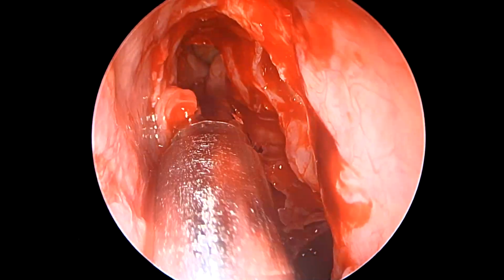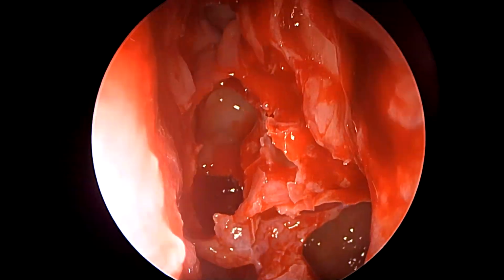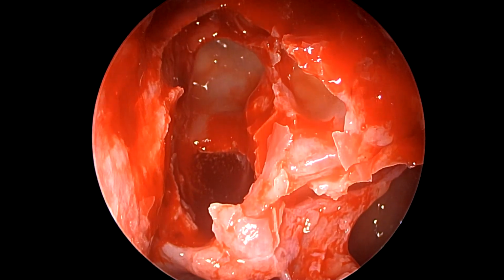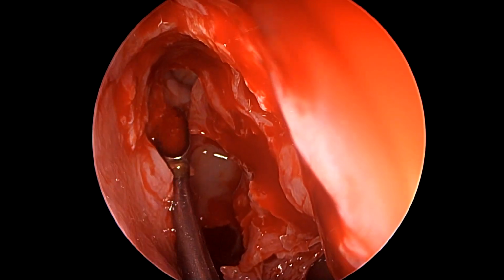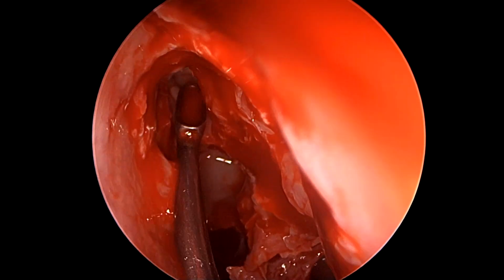So as we see here, once a basic opening has been done, we take our microdebrider blade to remove the septation in the ethmoidectomy cavity. We can already probably see our view inside that large suprabullar cell anteriorly, which we will start fracturing if we are to conclusively see the frontal sinus.